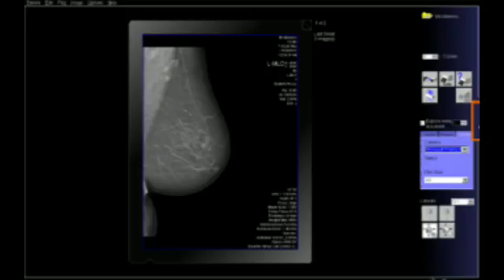Once our post processing is complete, we will be selecting the filming panel. Once we select the filming panel, you can select the layout, whether you want to give it in a single layout, or in 4 cuts on a single film. This is how the monitor will show, as well as you can check the patient card identities, the brightness, contrast, everything. This is how we do the last final step, and we give it to the print.